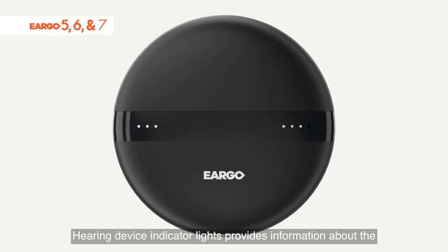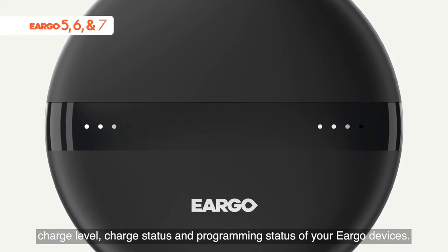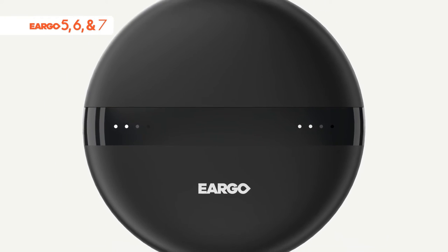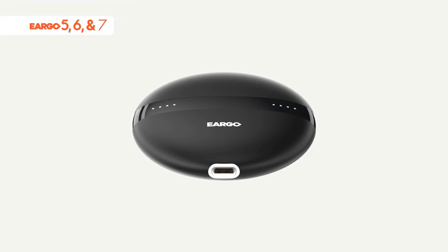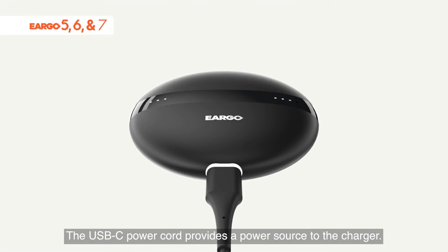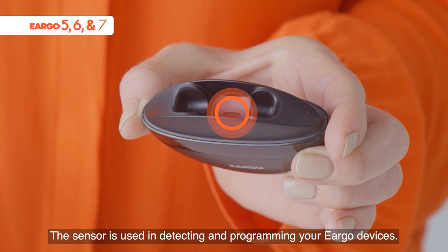Hearing device indicator lights provide information about the charge level, charge status, and programming status of your Eargo devices. The charger indicator light provides information about the charge level and programming status of the charger. The USB-C power cord provides a power source to the charger. The sensor is used in detecting and programming your Eargo devices.